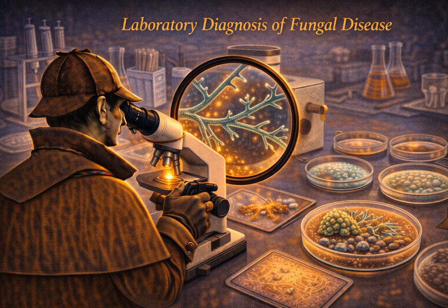Now contrast that with Mucor or Rhizopus. Mucormycetes are the messy ones. They have those broad non-septate or pauciseptate hyphae we talked about. They look like twisted, irregular ribbons. The width varies wildly, sometimes fat, sometimes thin, and they branch at very wide angles, often full 90 degrees. So Aspergillus is tight, acute, segmented. Mucor is broad, open, irregular, wide branching. Correct. And Rhizopus specifically has these root-like structures called rhizoids that actually anchor it down into the agar, hence the name Rhizopus, meaning root foot.